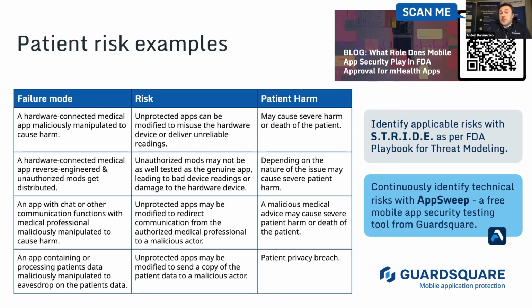Talking about the risks. Usually, medical device regulations such as FDA regulations or EU MDR or other country regulations prescribe you to do product risk management. And application tampering is no exception to that. So you also have to do your risk management when it comes to tampering risks. Here on this slide, we have a few examples of failure modes and risks and associated patient harms that can come from application tampering.